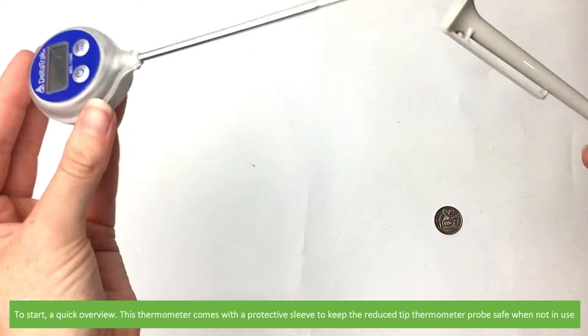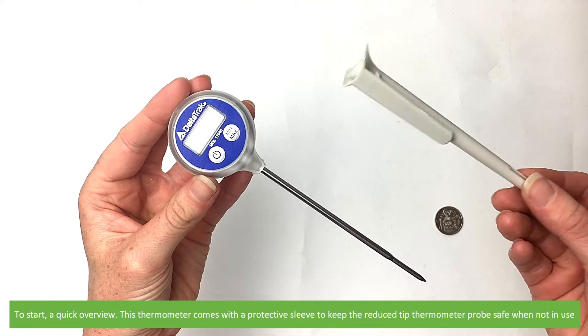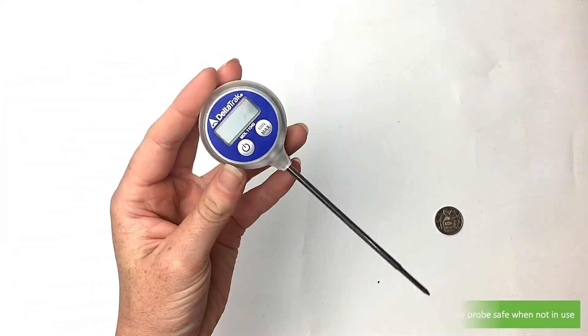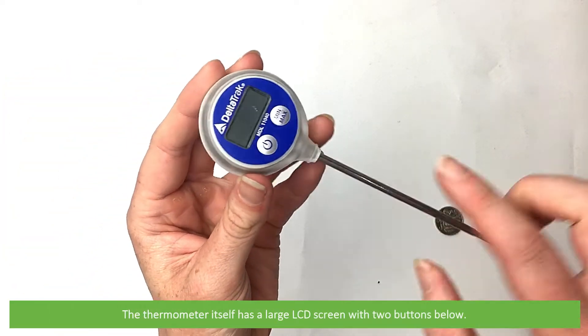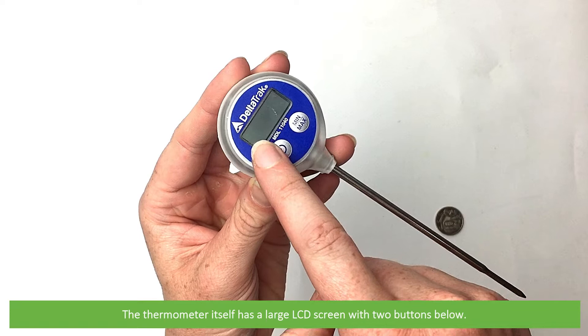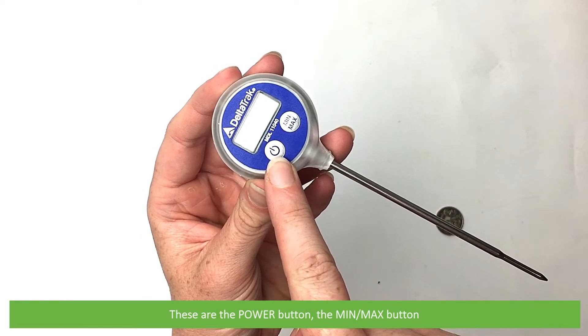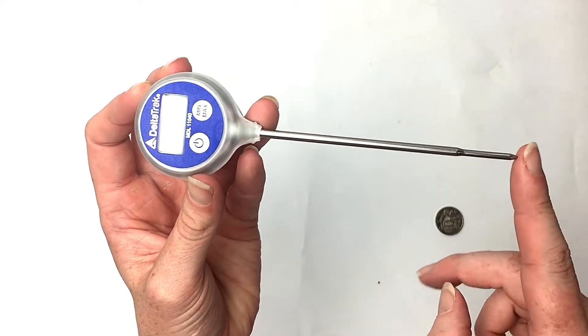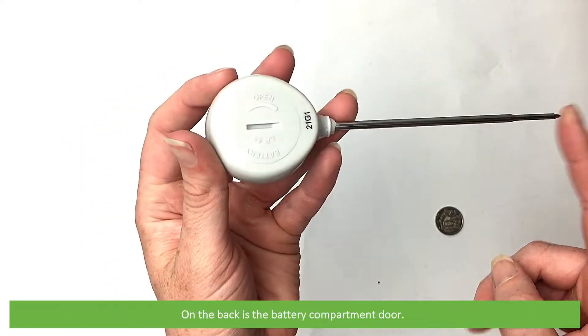To start, a quick overview: this thermometer comes with a protective sleeve to keep the reduced tip thermometer probe safe when not in use. The thermometer itself has a large LCD screen with two buttons below — these are the power button and the min-max button. On the back is a battery compartment door.